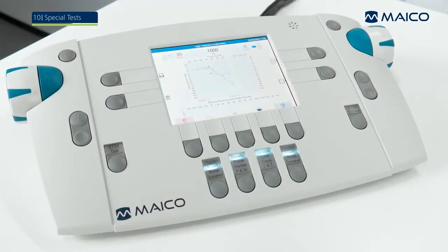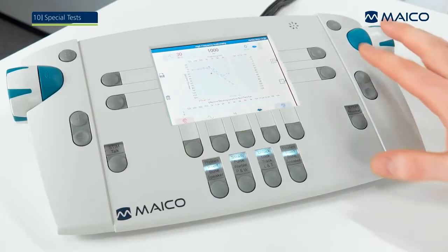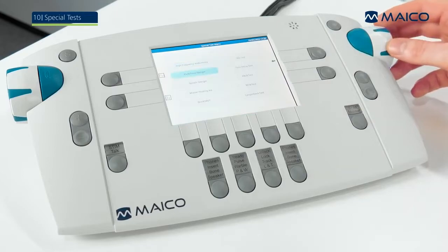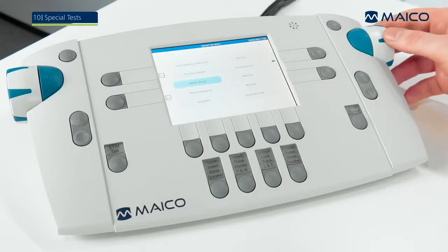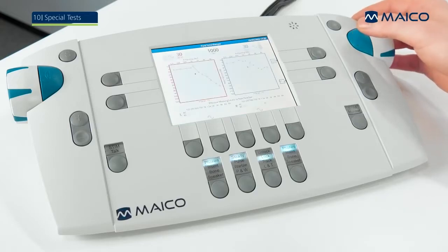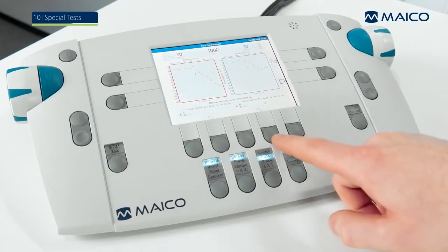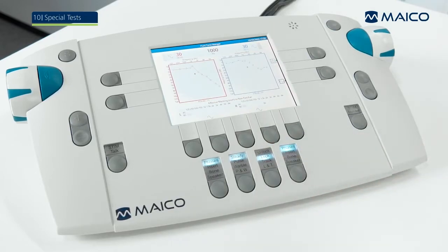The pure-tone and speech Stenger and the master hearing aid are test tools in the special test menu. Storing and data management is not supported by the test tools. The Stenger screens are reduced pure-tone or speech audiometry screens with fixed settings. The tone or speech input is pre-selected as a binaural signal type in both channels. The Stenger screens display previously measured test results to facilitate the test procedure.